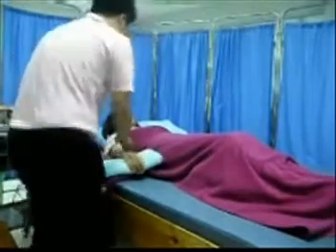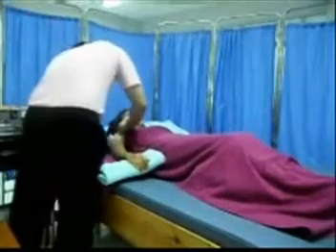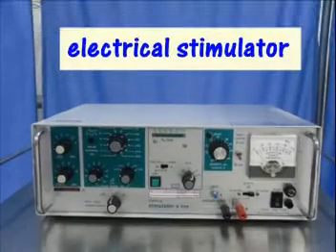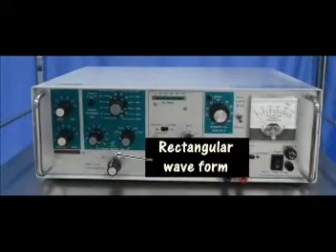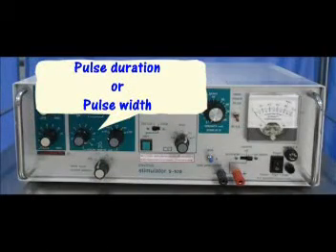When you know the severity of the nerve lesion from the chronaxie value, you can use this information to set the parameters for denervated muscle stimulation. The parameters are composed of: 1. Current type. We should use interrupted direct current. Interrupted direct current has two waveforms: 1. Triangular waveform. 2. Rectangular waveform. Pulse duration, or pulse width, means the duration of stimulation based on the chronaxie of the patient.